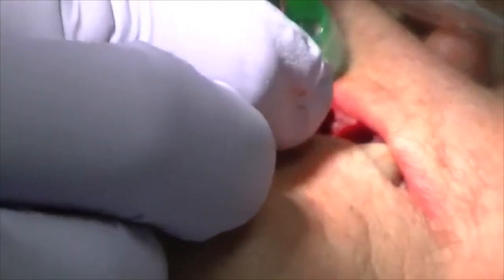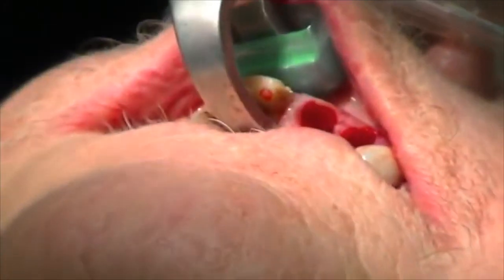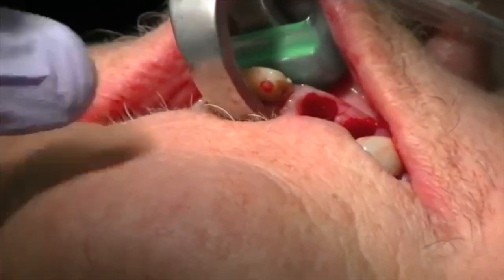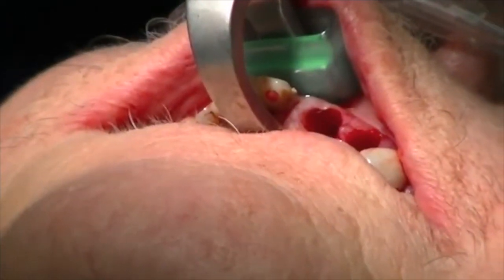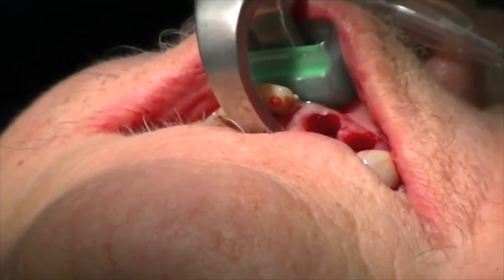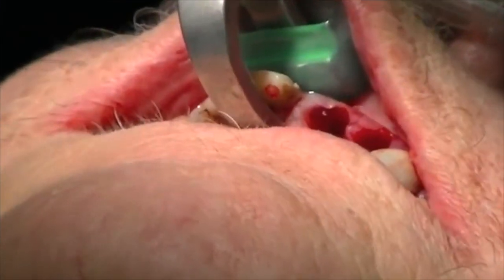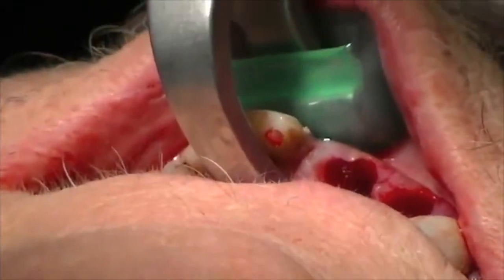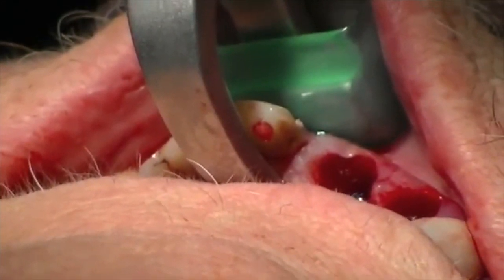Let's take out the next central. There's no forearm, there's no bicep, there's no shoulder pressure. It's really just the rotational motion that is elevating that tooth up and out of the socket. Some of you will say, well, how about the facial bone? Is that bumper holding the facial bone? Really not. The bumper is acting as a fulcrum, but it's not really doing any of the work. The rotation of my wrist is doing the work.